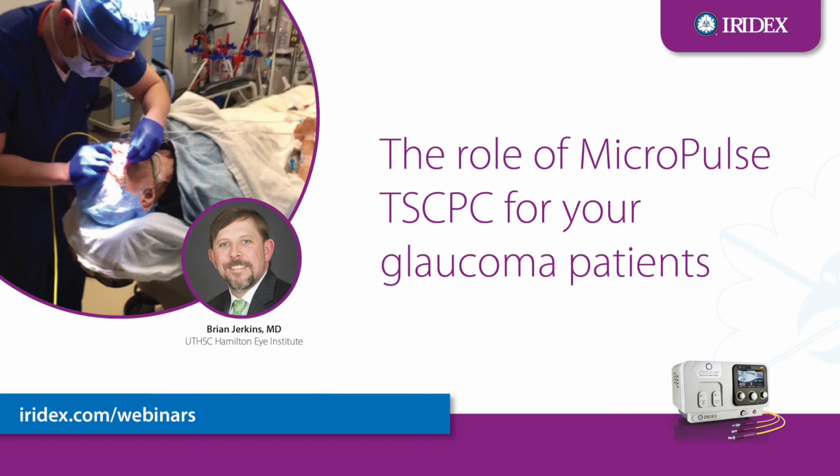I have done it on some diabetic patients, certainly who've had neovascular glaucoma and had a tube in the eye. And I find MicroPulse to be absolutely a great option after a failed tube. And a lot of these diabetic patients do have macular edema, and I've not really seen where it's adding a lot of macular edema. So it may be something that I should be more routinely doing OCT preoperatively, but I'm currently not. But if they are dropping vision afterwards, it is something that I will screen for more post-operatively.